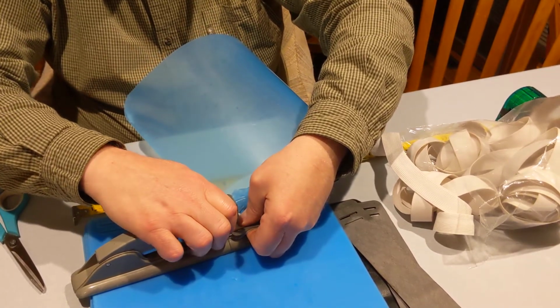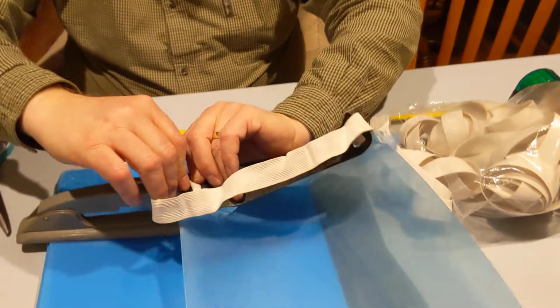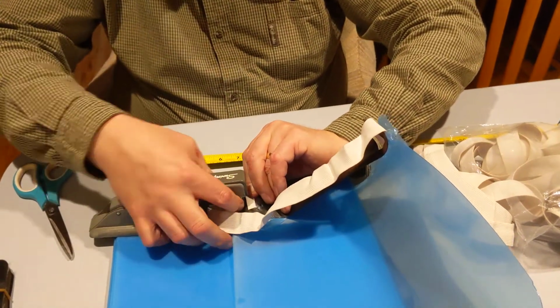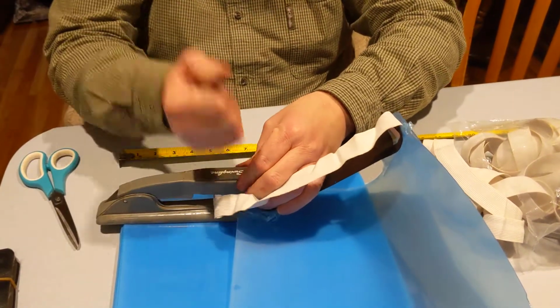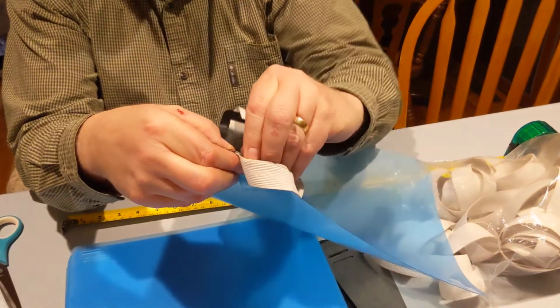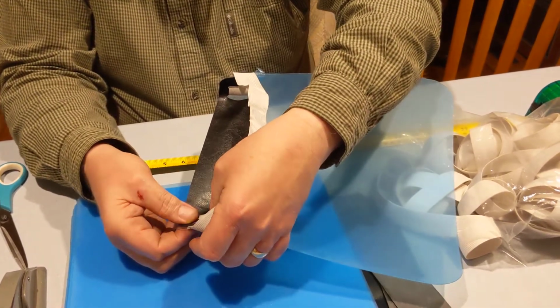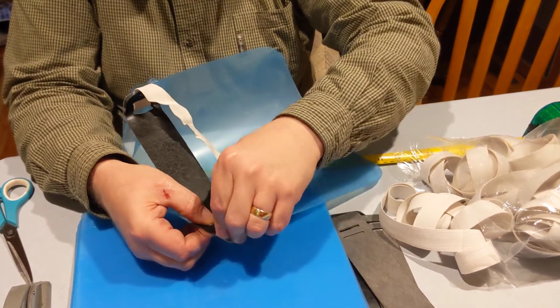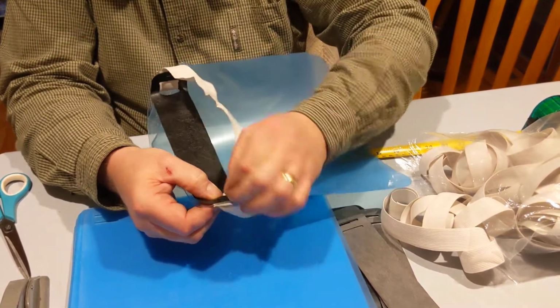And again, remember, the smooth side of the staple should be, I'm doing it wrong, I need to turn it over. It should be this way so that the smooth side of the staple is on the inside of the face shield. Get it positioned, and again, a good hard press, and it's stapled in place. Now this time, this doesn't happen often, but the staple did not seat neatly. It actually holds adequately, but I think I will adjust this, take it out with a small screwdriver or something and staple again. So if that happens, just remove the staple that didn't work.